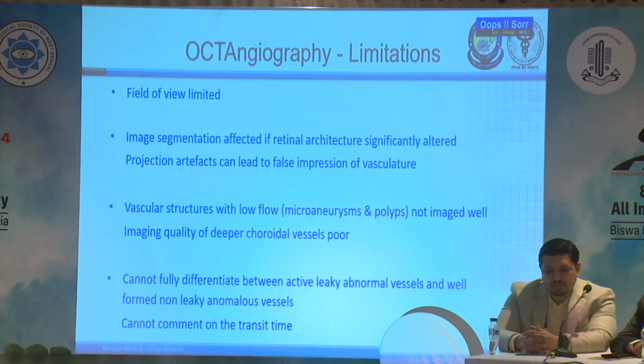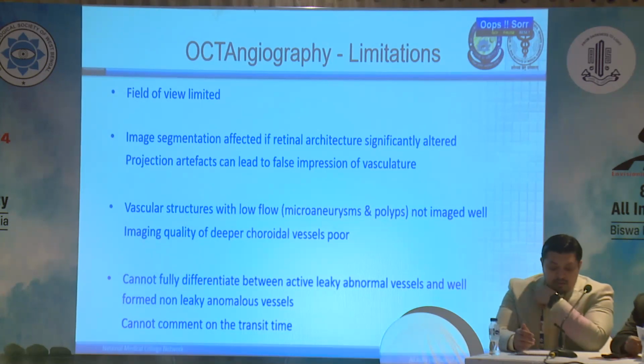Coming to the limitations, that is my last slide. So you have certain limitations of OCT angiography, that is the field of view may be limited, although we are coming up with wider ultra-wide field scans also, but they are affected by motion artifacts and other artifacts. You have the segmentation and the projection artifacts that may impede the quality of your scans. Then the vascular structures with low flow, such as microaneurysms and polyps, may not be imaged well, and they may be missed, and you may not be able to differentiate between leaky as well as non-leaky abnormal vessels, and cannot comment on the transit time in OCT angiography.